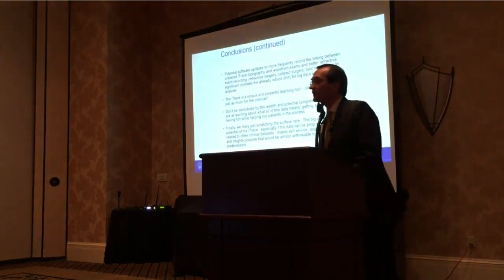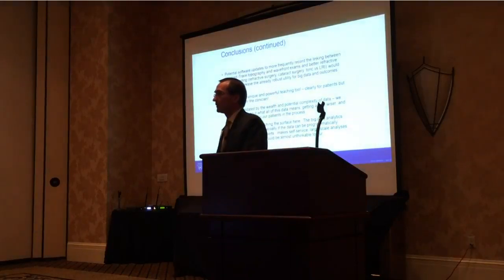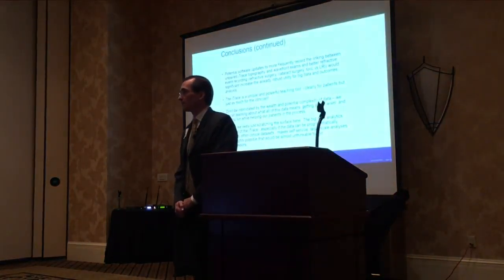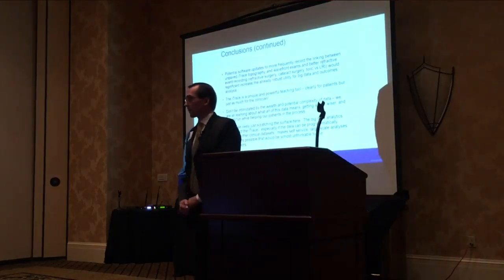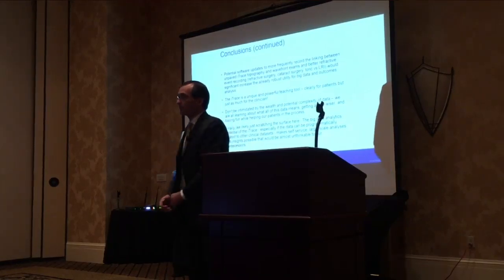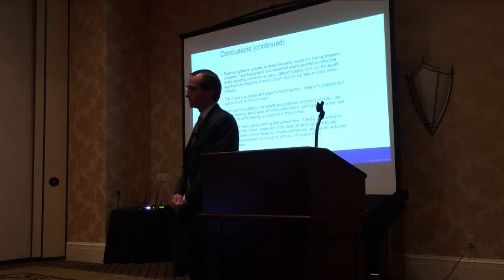As I understand it, angle alpha is the white-to-white related to the visual axis, done in a pre-op test. So it's not really the IOL; you're making an estimate of what theoretically would be. Yeah, that's exactly right. With the multifocal lens, we can visually see where it is, assuming the visual axis didn't change.